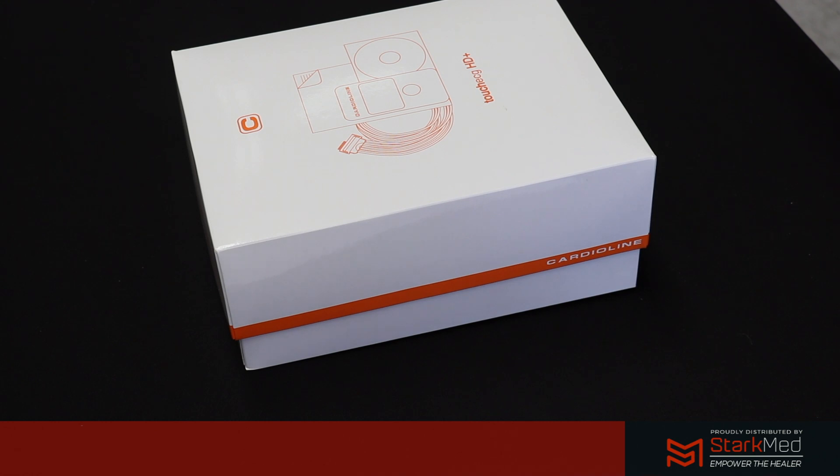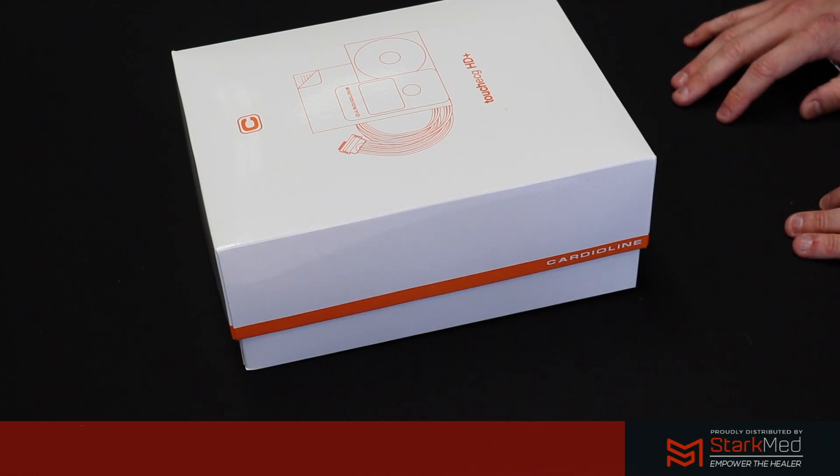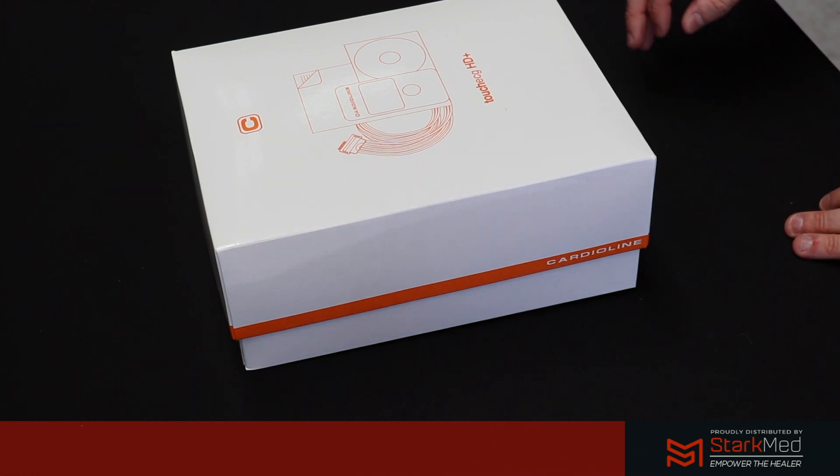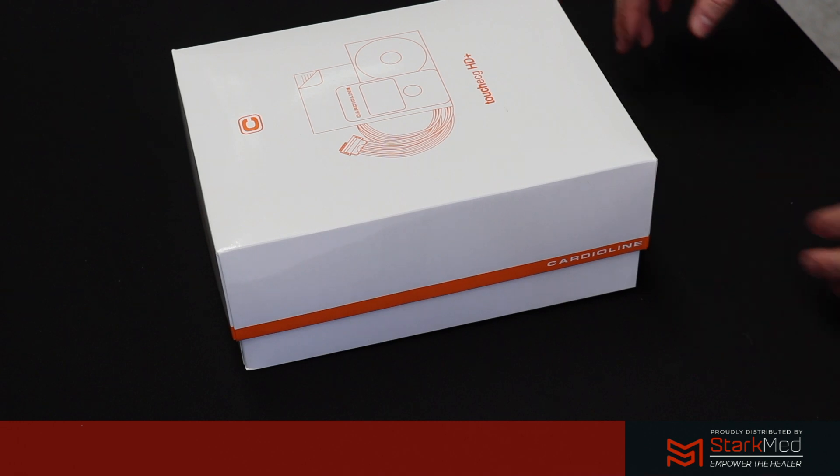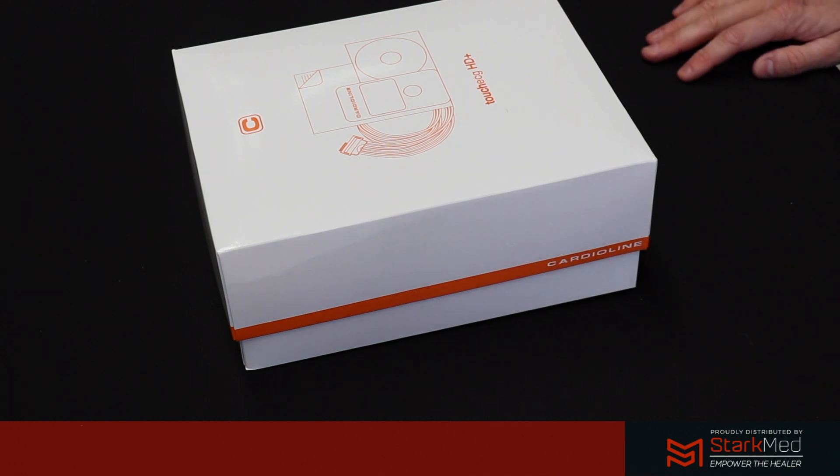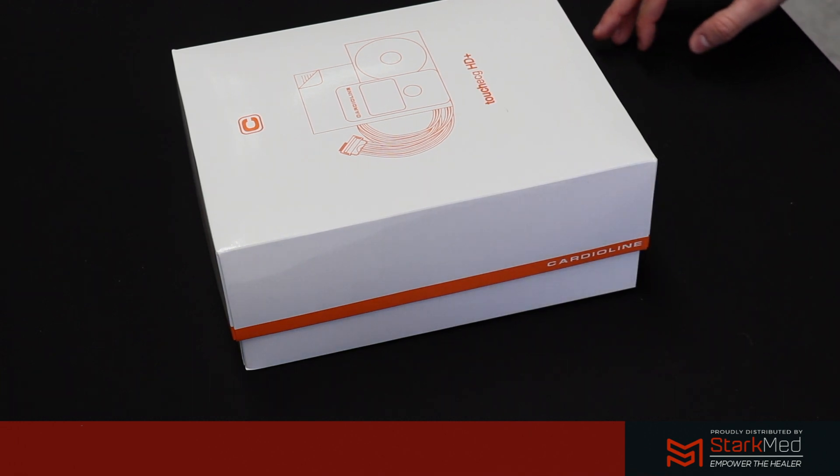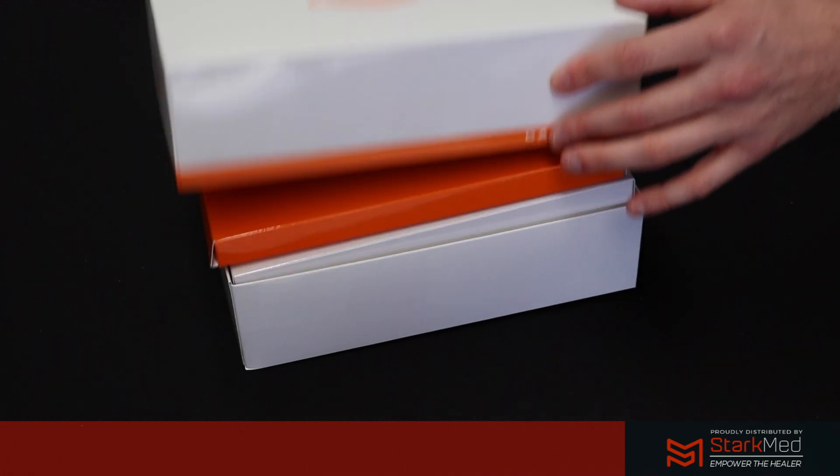Hi everybody and welcome to the Cardio Line Touch ECG webinar. We're going to go through a quick video demonstration of what you receive in the box and how to set up the acquisition unit. If you open up your box, firstly you'll notice the acquisition unit is on the top row.